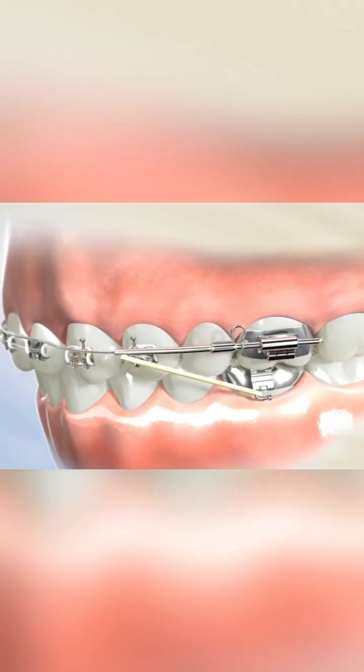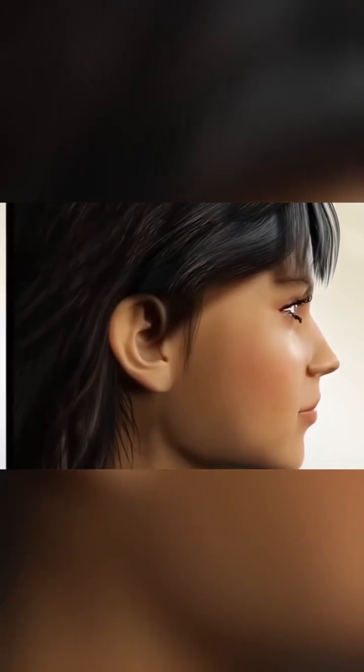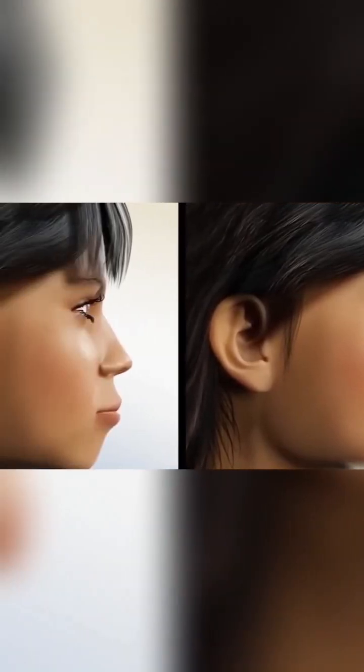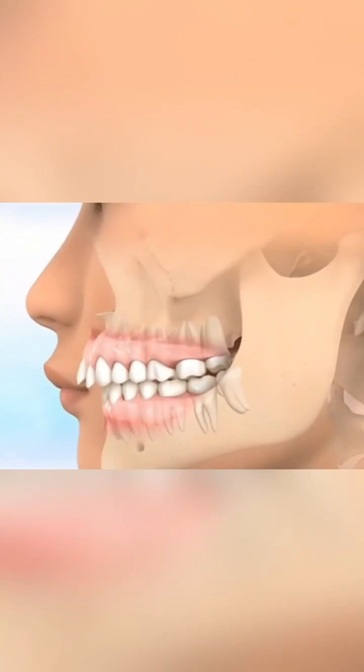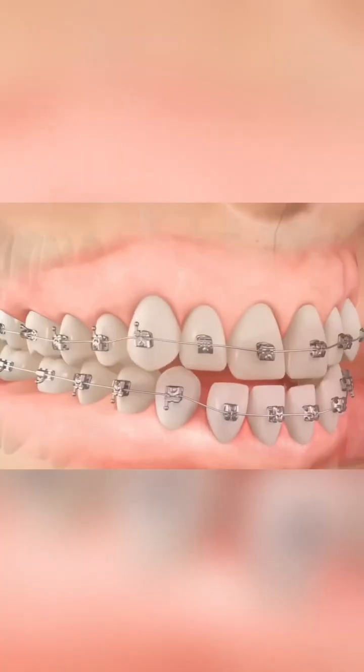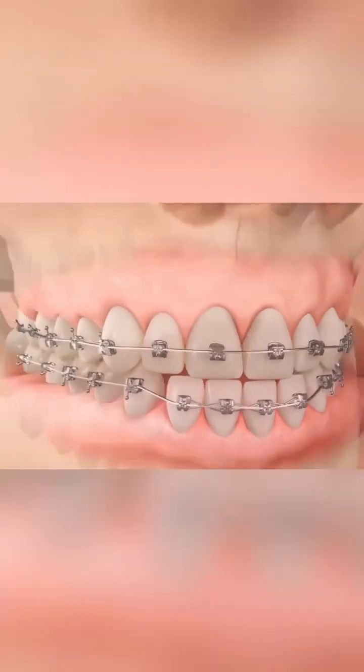As the teeth gradually shift, your appearance will undergo an incredible transformation, comparable to cosmetic surgery. The alveolar bone, which supports the teeth and also provides structure for the lips, will reshape under the applied pressure during the process of tooth movement to accommodate the new positions of the teeth.